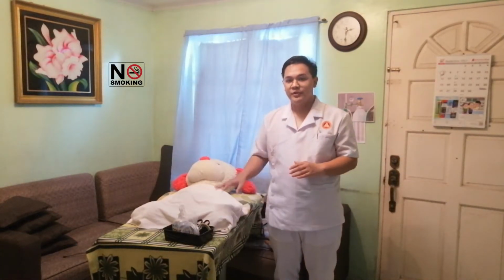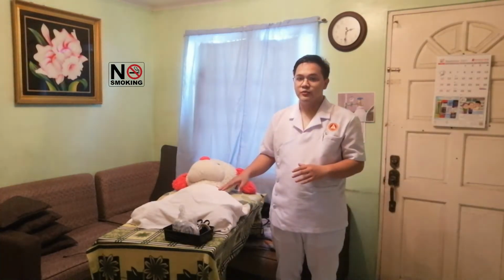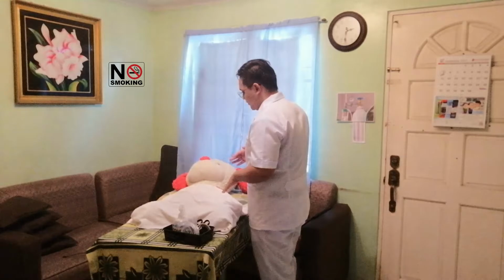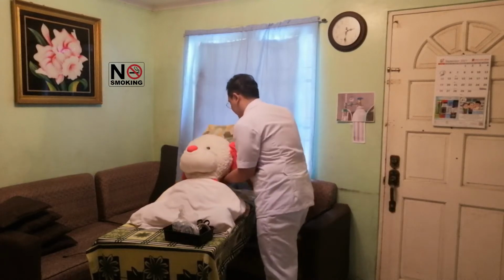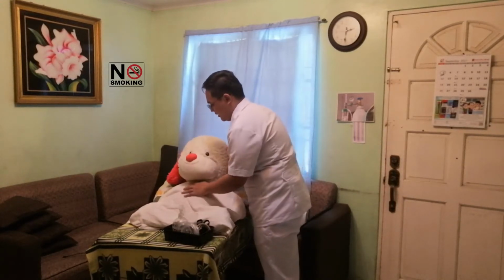And after that, we will need to prepare our client and the support people. So first thing that we need to do is position our client in a semi-Fowler position. So ma'am, angat lang po natin konti into a semi-Fowler position. So sasandal lang po kayo. Okay po? Ito po yung 3, 2, 1. Okay.